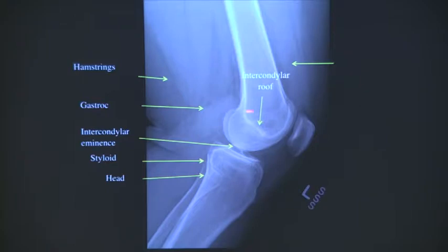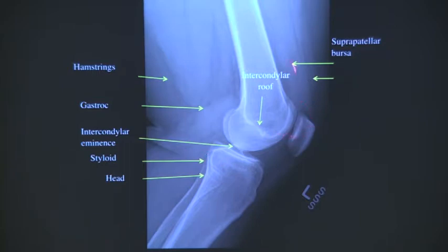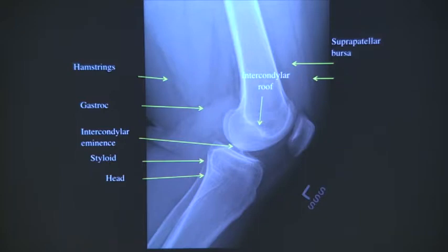Suprapatellar bursa - yes, suprapatellar bursa with fluid. Any small amount of fluid will go up here. Don't look for effusion there on the frontal view. Any small amount of fluid will go to the suprapatellar recess. Suprapatellar recess is a better term than suprapatellar bursa.